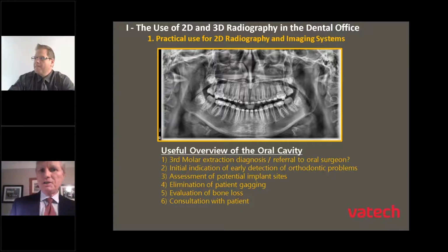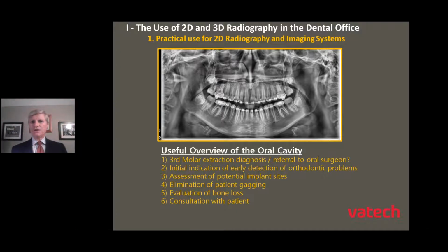So, talking about 2D radiography in the dental practice itself, okay? Certainly there's still value in 2D radiography. There's a list that I have here, such as looking at third molar extractions, looking at early indications for orthodontic problems, assessment for potential implant sites, okay? Elimination of gagging for patients, because now you're not using an intraoral sensor, which can be more invasive for some patients, okay? Evaluation for bone loss, certainly, and also as general consultation for a patient, because most patients, when looking at an image like this, should be able to interpret the anatomy fairly easily, okay?